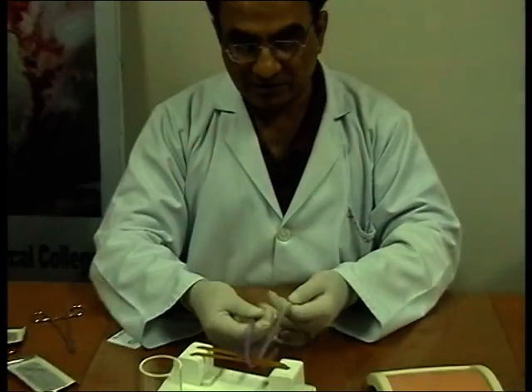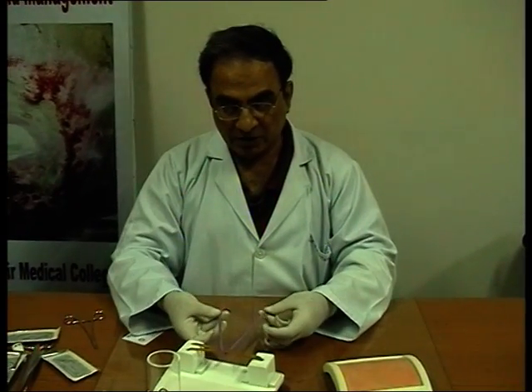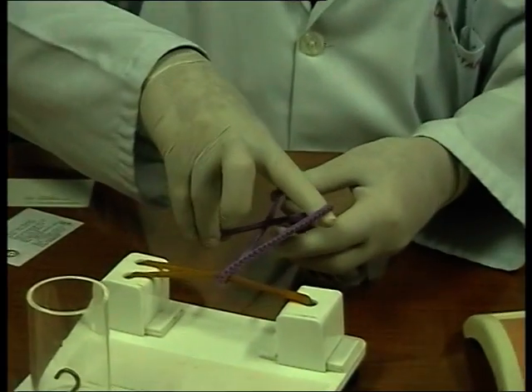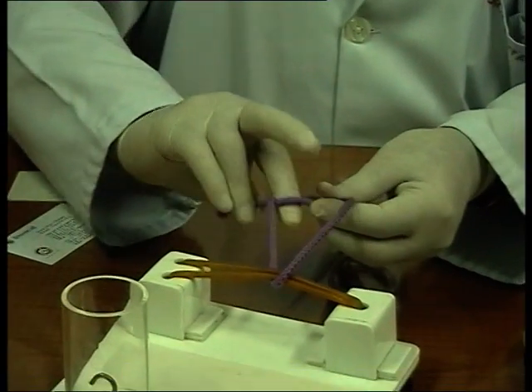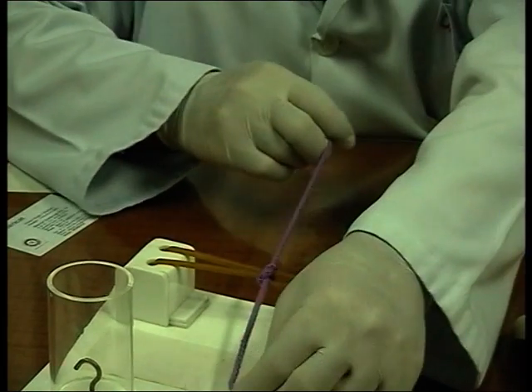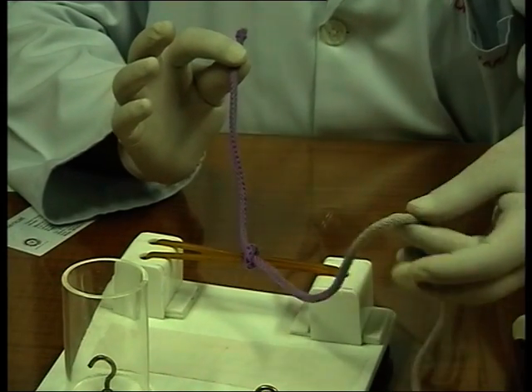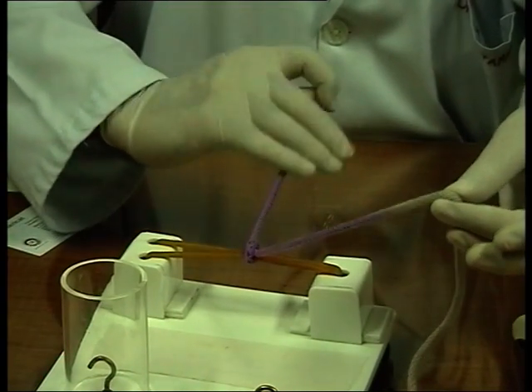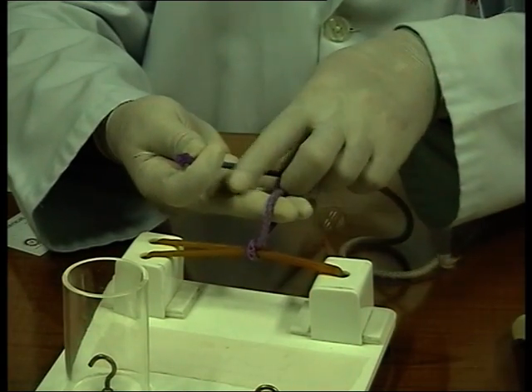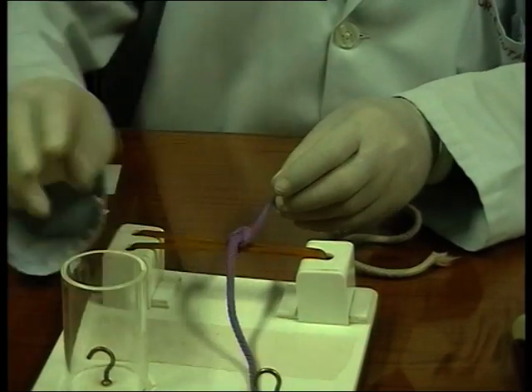So just to repeat all the knots quickly, the reef knot: short end is away from me, long end is towards me. I'm going to put an index finger through, make a figure of 4, fish it out with my index finger, secure with the middle, cross, hold this like a dart, short end, the other one between the ring and the thumb, wrap it around my 3 fingers, bring the other one right across, keep a distance of about 3 centimeters here for the loop to be negotiated, and that's a reef knot.